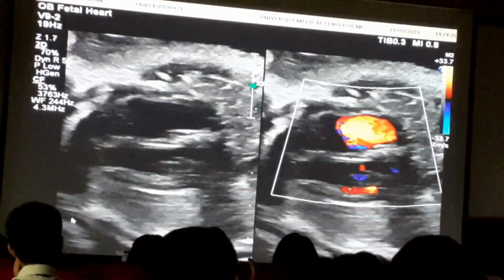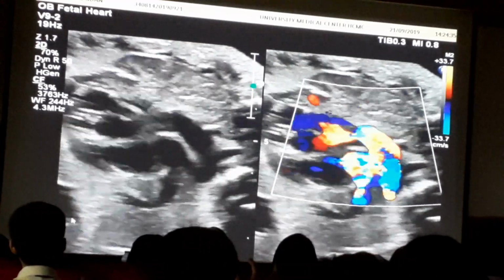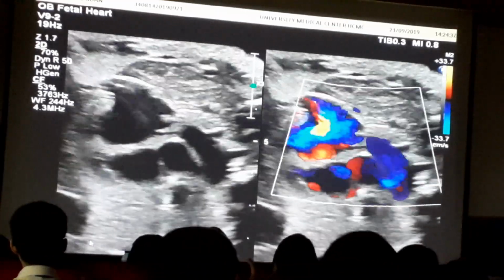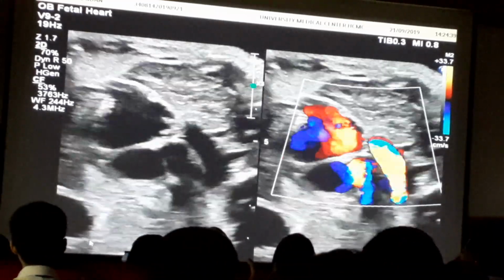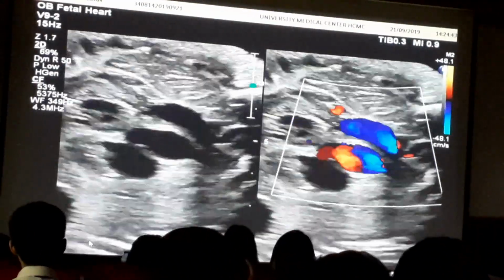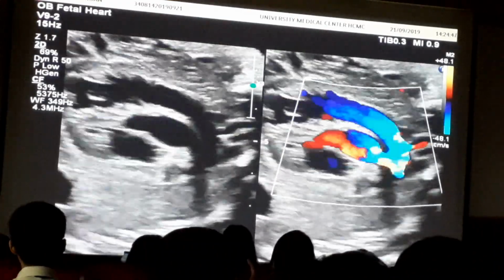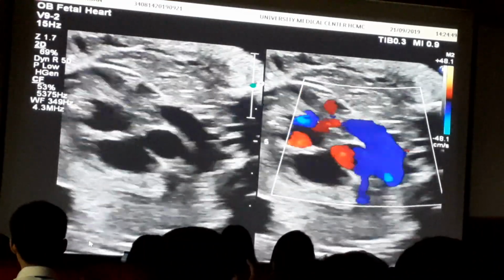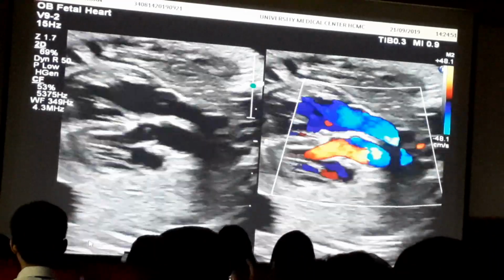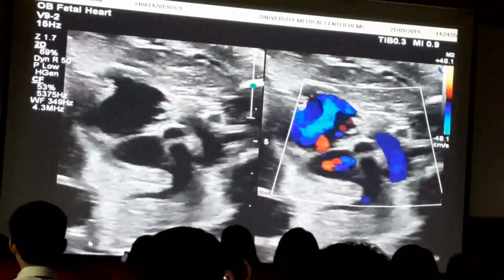Theo cô thì với những cái biểu hiện như thế này thì khả năng em bé này sinh ra đời thì phải để ở cái chỗ mà có thể can thiệp cấp cứu được. Phải phá vách liên nhĩ. But having made the prenatal diagnosis, I think overall prognosis would be good, as long as there are no other anomalies. Thì chúng ta thấy là tất cả những cái biểu hiện đó, mặc dù có phổi, có tim, nhưng mà nói chung là cái tiên lượng của em bé này tốt.